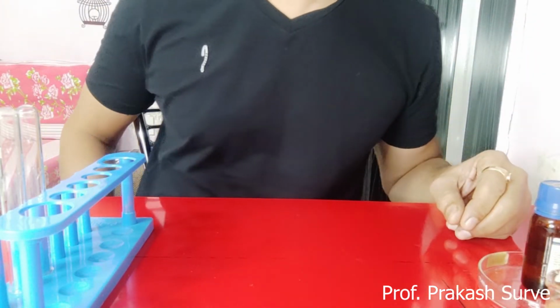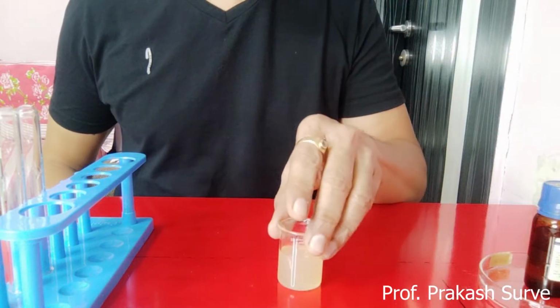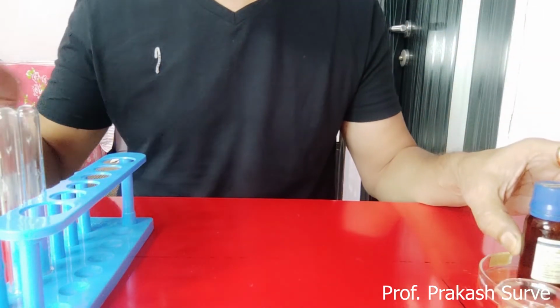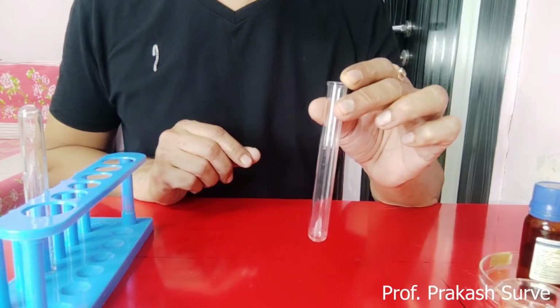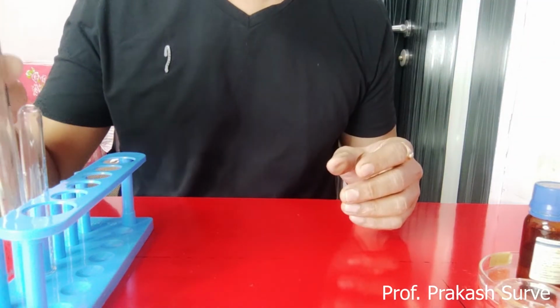The next test we are going to perform is the test for albumin, for which the requirements are the urine sample, concentrated nitric acid, and the test tube. So these are the requirements for the test for albumin. Before doing the test, what is albumin?